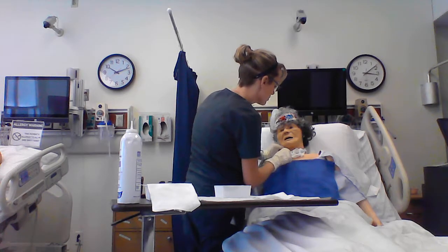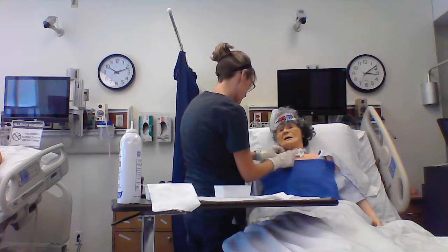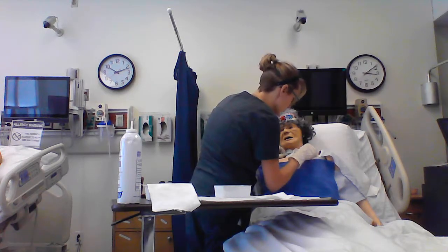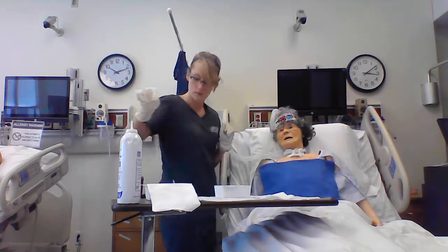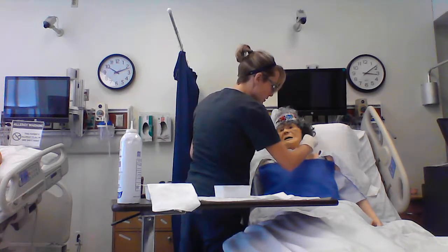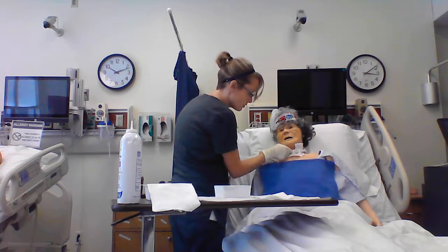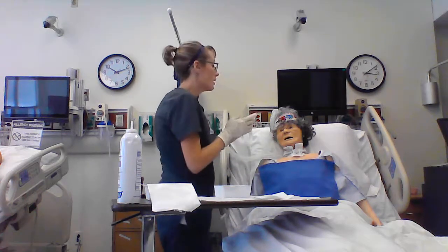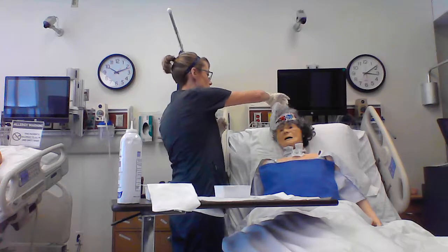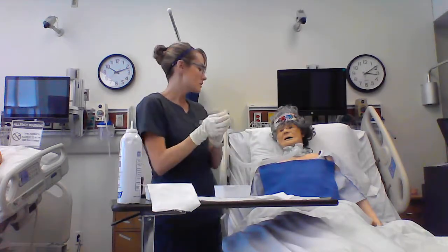I'm going to contaminate my hand pretty good here and pull this through here, or tuck this, tuck. Okay. And then I would take my cleanest hand that I have and pull these sponges up so that they're flush with the tubing. I'm going to put our oxygen back on here. So then you can take these gloves off.